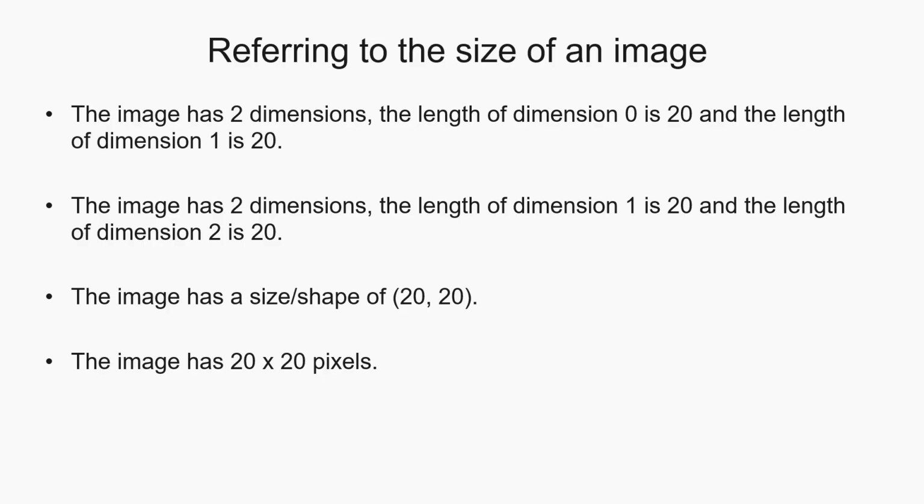Another important note is that some coding programs start their counting from 0 instead of from 1. So knowing which of these is used is important, and hence you can describe an image by its dimension starting from 0, or with the first dimension being 1.